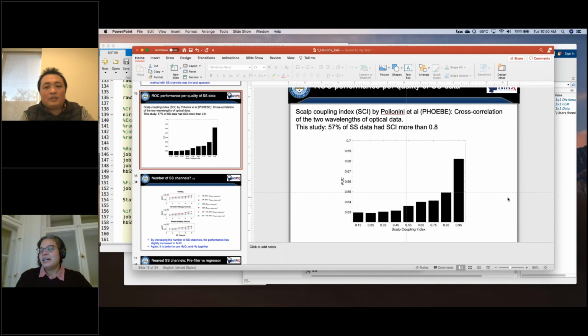Thank you. And for the short separation, we cannot adjust it again, right, because it's already there. After we put on the cap, we cannot do anything. But from our experience, more than 50% of the data is above 0.8 for the SCI. It's okay. Very good.